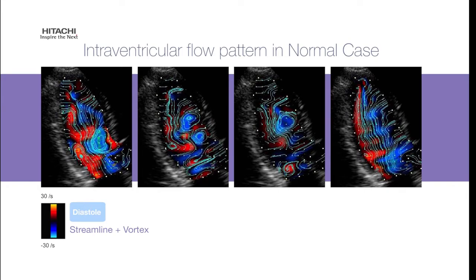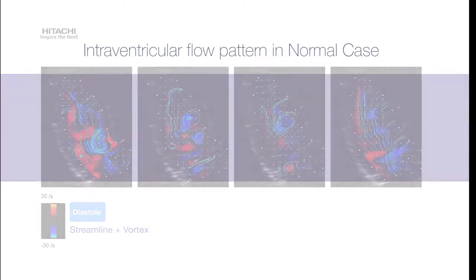A diastolic vortex ring appears to function as a temporary kinetic energy reservoir during the pre-ejection phase that supports blood redirection into the outflow tract and generates a force that initiates timely closure of the mitral valve.